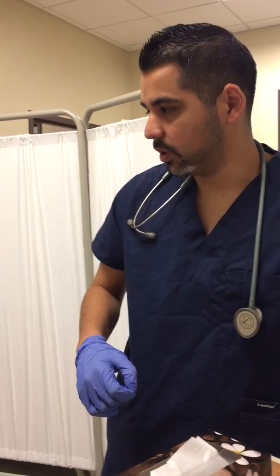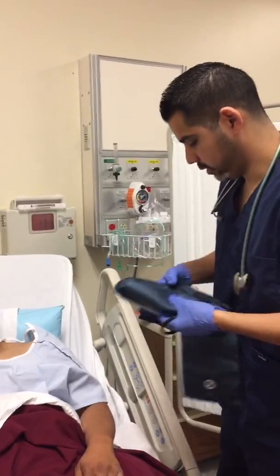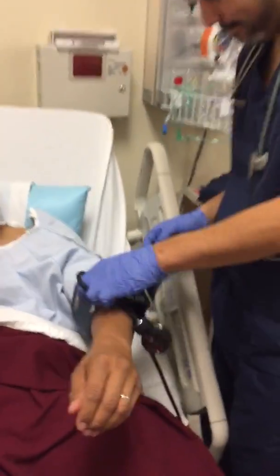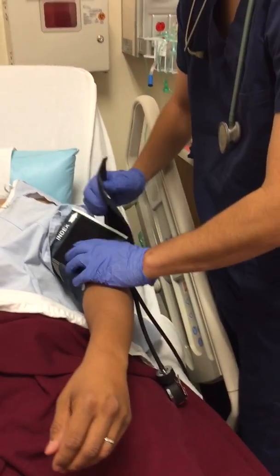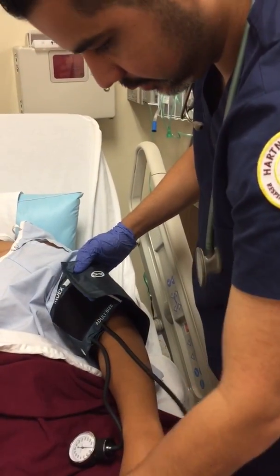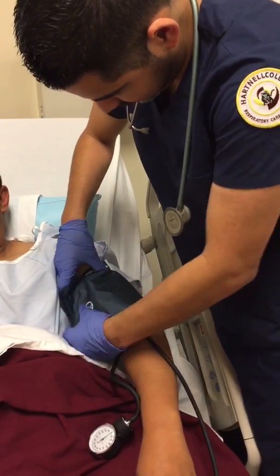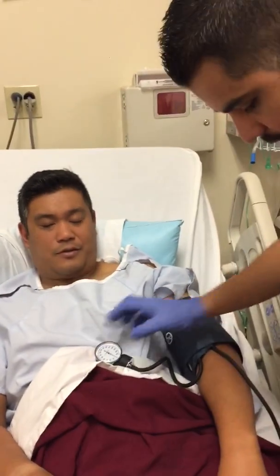Okay, now I'm going to be taking blood pressure. Just gonna wrap this around your arm, okay? Go ahead and breathe normally, okay? You did a great job. I'm just gonna rest this right here, okay?